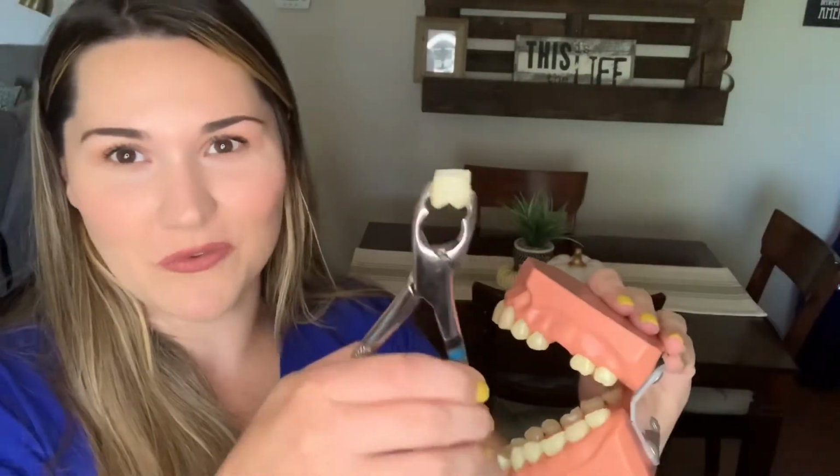Now a normal tooth would have roots, but this is a model, so it doesn't. But then it will come out like so. And then if you're an assistant, you'll have a gauze in your hand or whatever you want to, but he'll hand you the instrument kind of like this and you'll take it, put it on your little counter or whatnot. And then there'll be a teeth collection somewhere that you have for a biohazard that you'll dispose of this in.